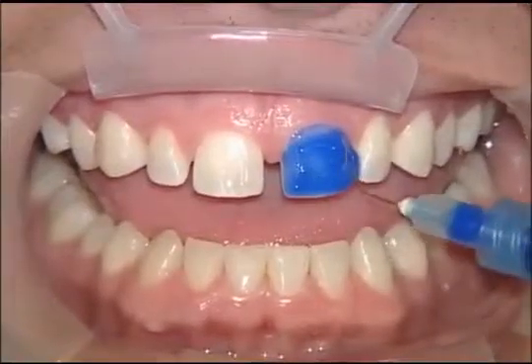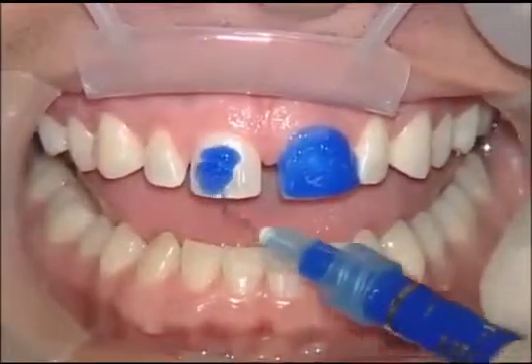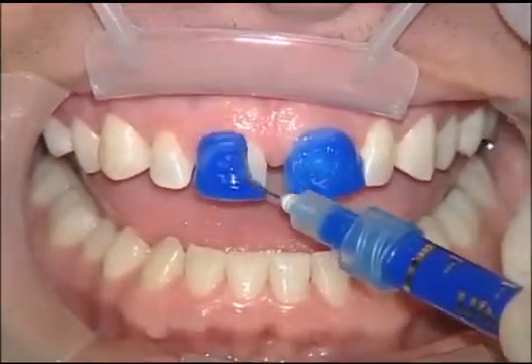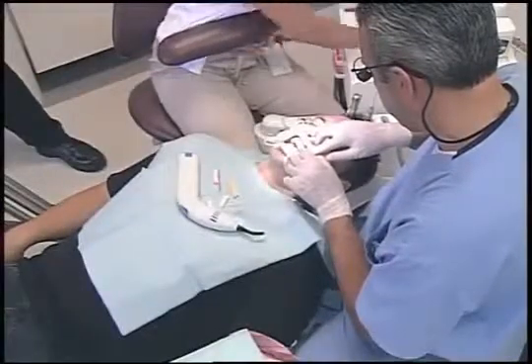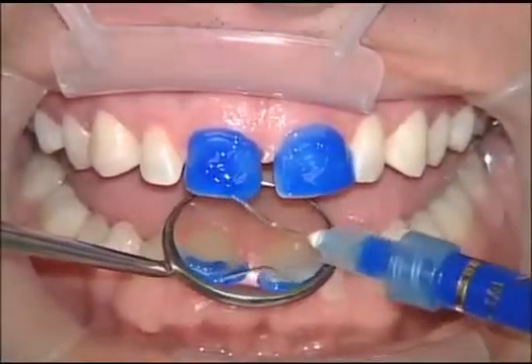One of the other nice things about no prep veneers is when you prep veneers and you have had temporaries on for a couple of weeks, the gingiva can get irritated, and the acid etch can actually make the gingiva bleed. Typically for no prep veneers, we have very healthy gingiva because there's been no prepping and no temporaries that have been in place. And as a result, we have the opportunity to go ahead and place the etch next to some healthy gingiva so we don't have to worry about bleeding.